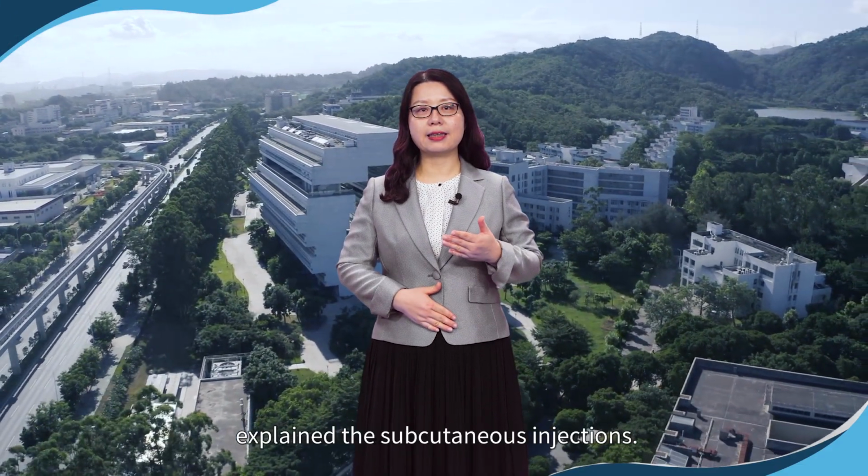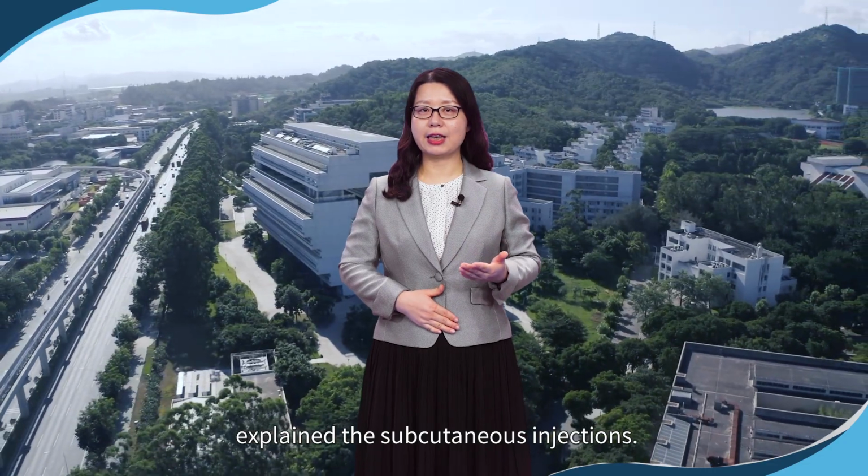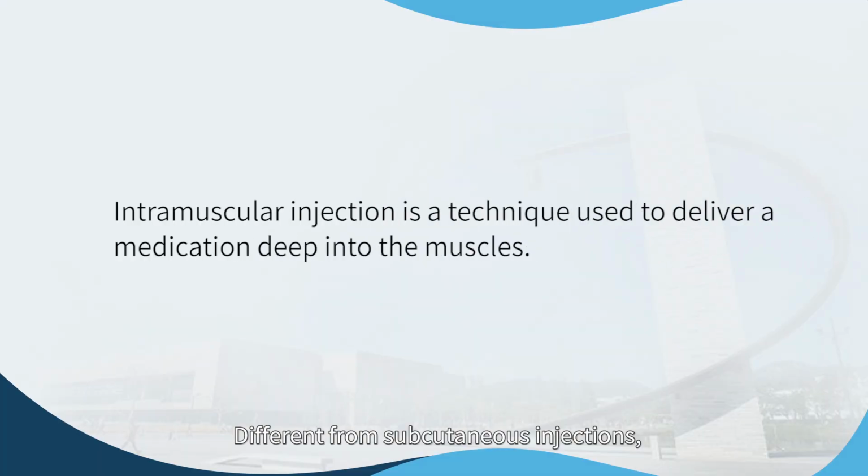In last session, Mrs. Wu explained the subcutaneous injection. Different from subcutaneous injections, IM is a technique used to deliver a medication deep into the muscles. Many medications and almost all injectable vaccines are delivered this way.